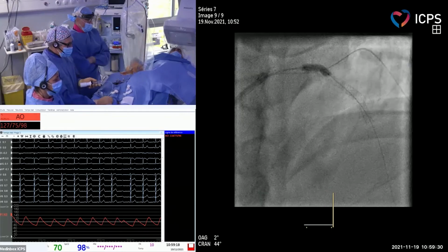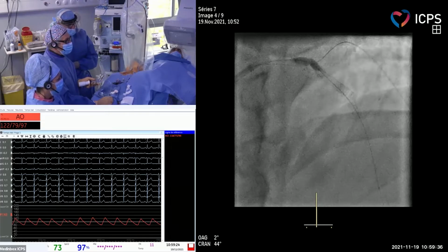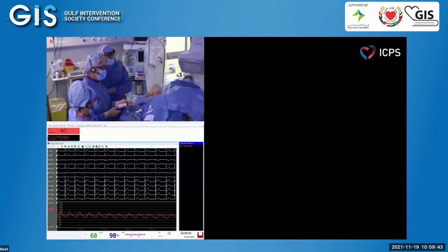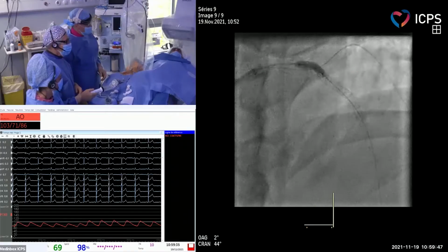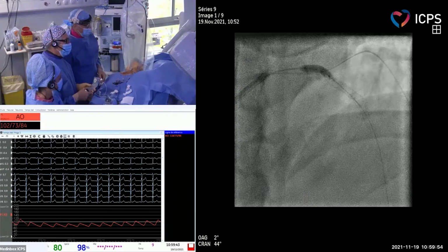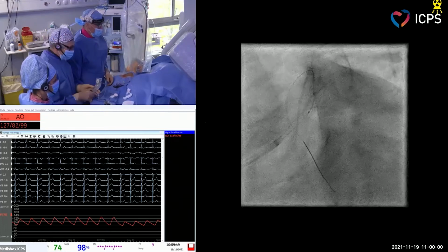So you can hear probably the shock. So we can do 10, 8 times, 6. Terry, can you change the angulation so that we could see in the different views, please? Yeah, of course. Thanks. Okay. So maybe we can move a little bit more again.